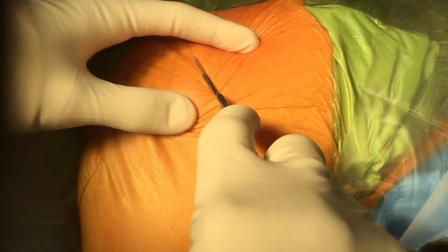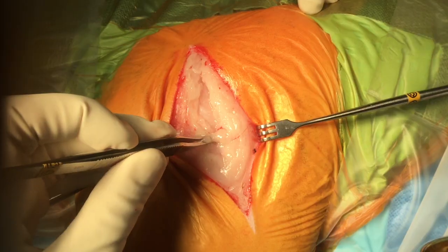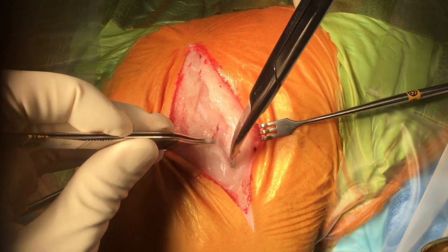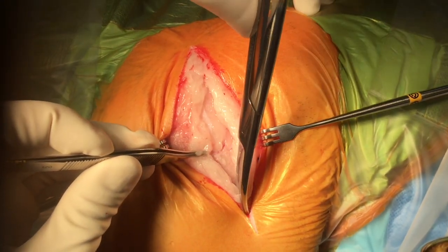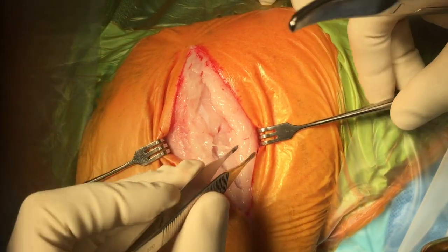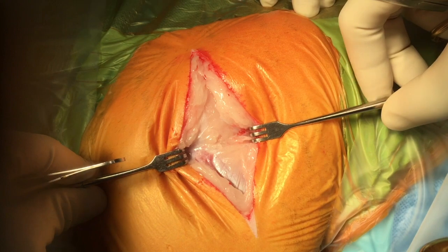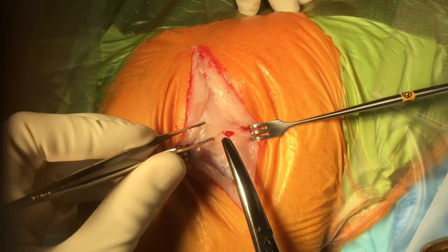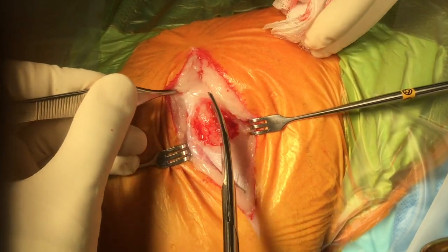We start with a routine cranial lateral approach to the hip. After incising the skin, we come through the thick fatty subcutaneous layer, then incise through the superficial fascia lata and some interposing fat.